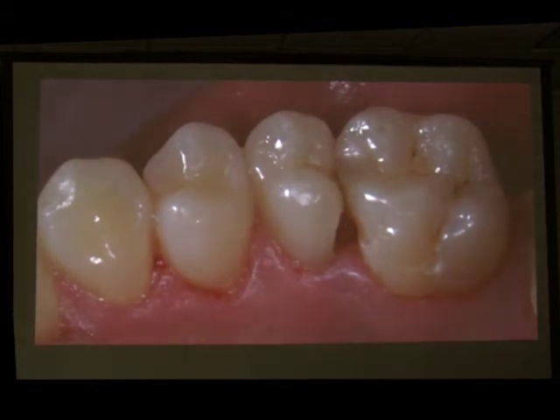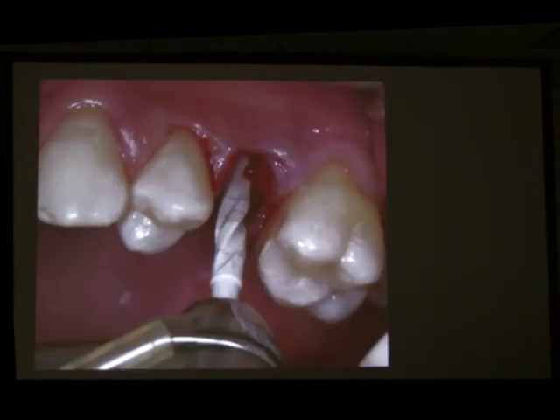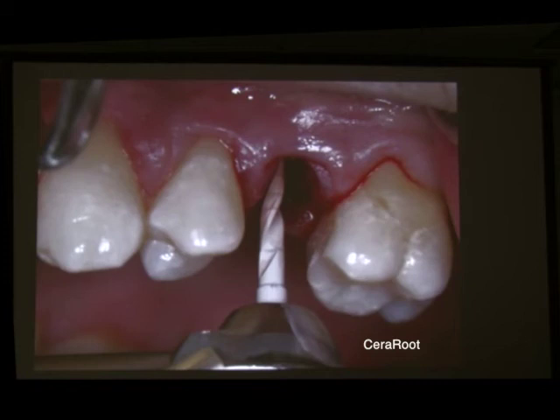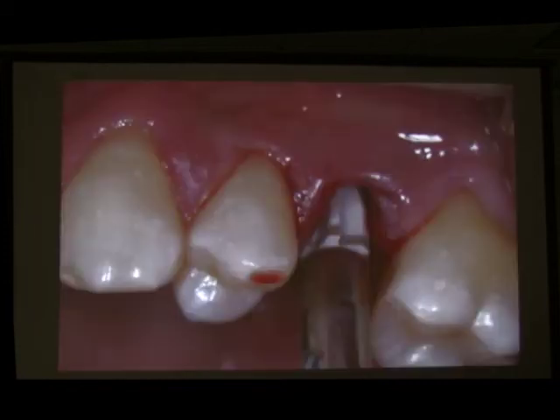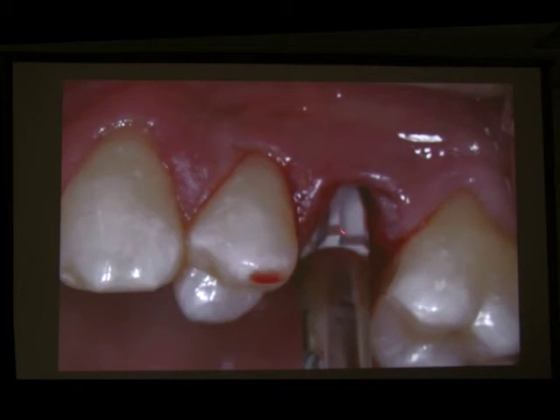I'm going to show you the technique step by step for the premolar. We extract this tooth. This patient did not want any type of root canal or reconstruction on the tooth, so we go ahead and extract it. And like I said before, we drill 2 millimeters deeper than the bone level, not gum level. So if we want to place a 12 millimeter implant, we measure 14 millimeters from this interproximal bone down. So we go ahead and do all the drill sequence. It's the initial drill. This is the 2.3 drill. This is the 2.8 drill, and then we use the 3.5. It's not shown here, but we use the 3.5. And after the 3.5, we go in with the countersink. When the socket is big enough, and we put the countersink in, sometimes we don't drill.